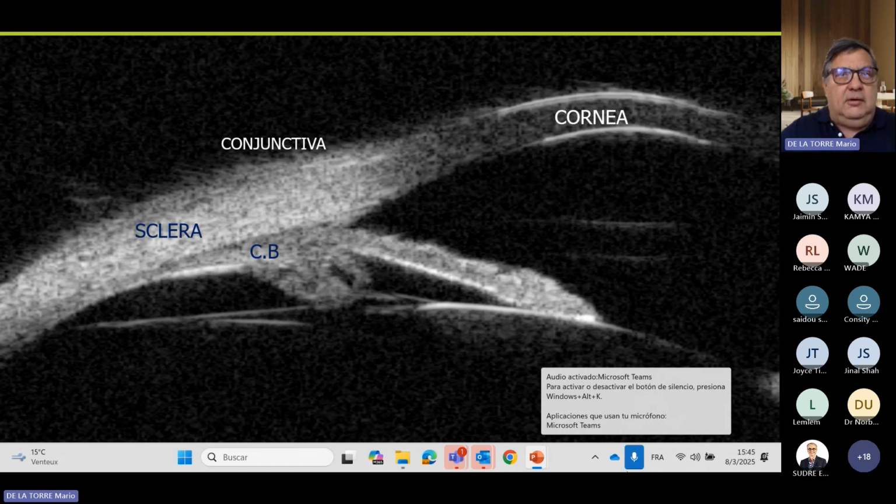And if you remember the classification of glaucoma, all the classifications are done by gonioscopy. That means we never took into account what happened behind the iris, what happened with the ciliary body, what happened with the movement. It was the result of the combination of the planar image of the gonioscope into a 3D image in the brain of the specialist about what happens in the angle.